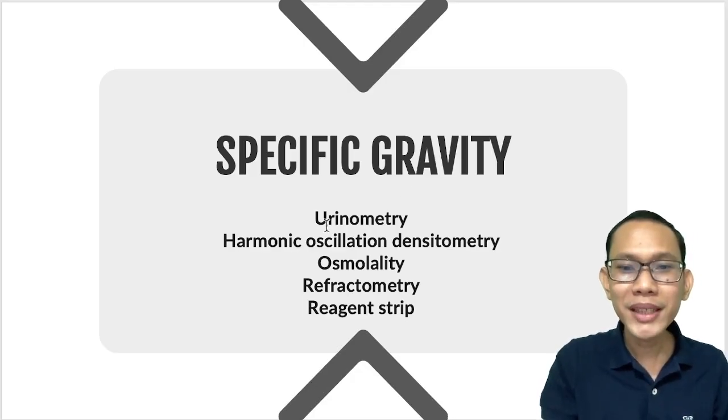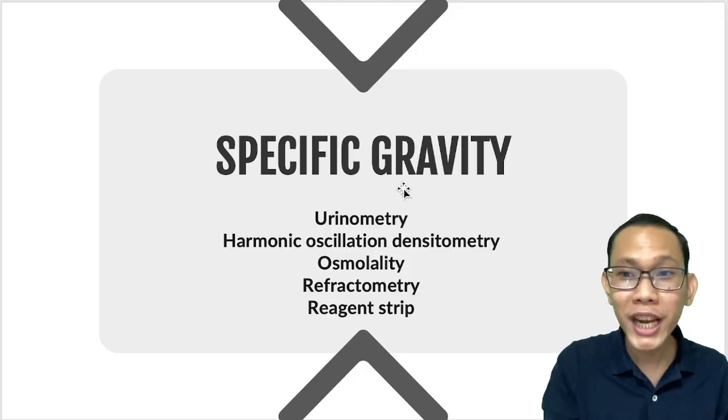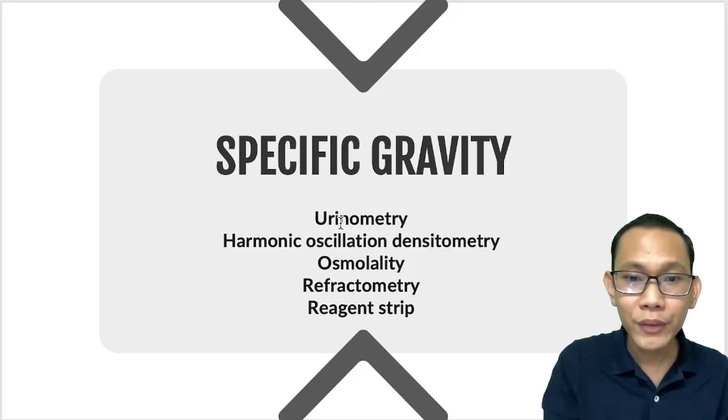So again, we will be discussing the different methodologies for specific gravity. We have urinometry, harmonic oscillation densitometry, osmolality, refractometry, and reagent strip.